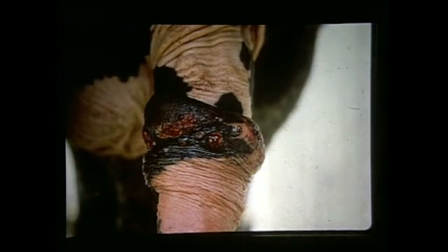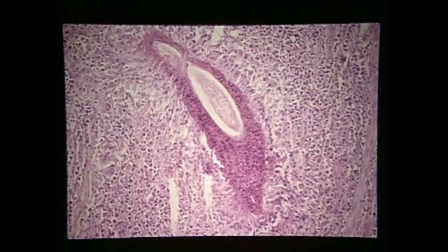A proliferative ulcerative change seen here is a result of habronemiasis, summer sores. In order to make the diagnosis, one at least has to demonstrate an overpopulation of eosinophils. But if one is fortunate, one can also identify the larvae. Many of those are in the process of being digested and typically will create a reaction characterized by this eosinophilic rim, which is partially the deposition of fibrin and partially the degeneration of eosinophils.